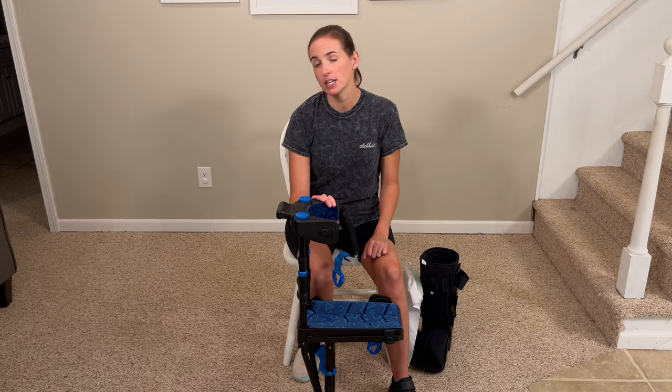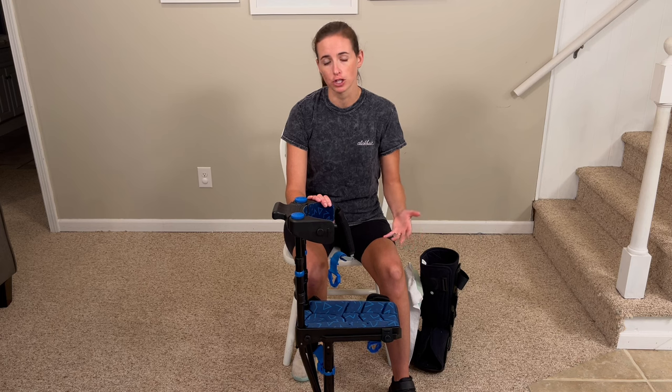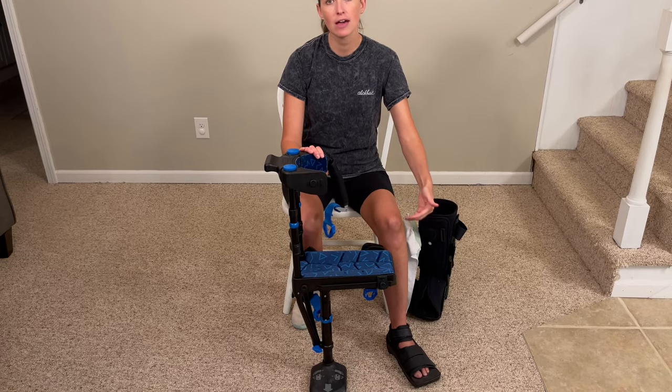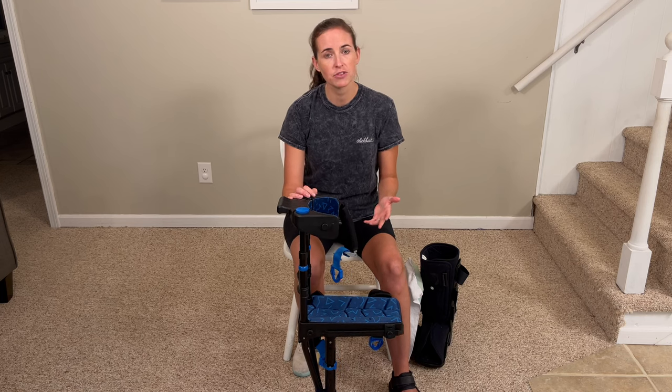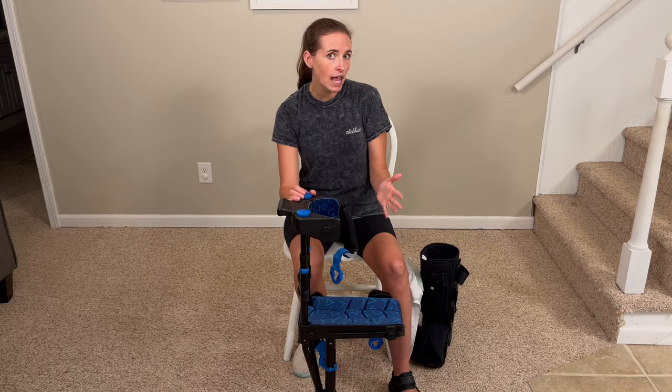Hi everyone, it's me Lindsay with EquipMeOT here today to talk about the iWalk 3.0, also familiar to some as the knee walker or the hands-free crutch. This is an awesome mobility aid specifically designed for individuals recovering from foot, ankle, or high ankle injuries. It's great for if you're non-weight bearing or partial weight bearing, because it allows you to be hands-free while you move. I've been using this for several weeks recovering from a fifth metatarsal fracture on my left foot, and I'm going to show you some things I liked and some I didn't.